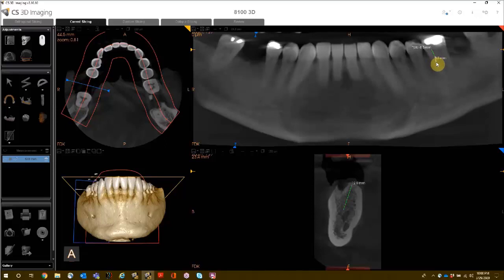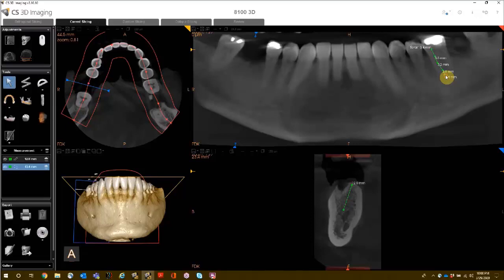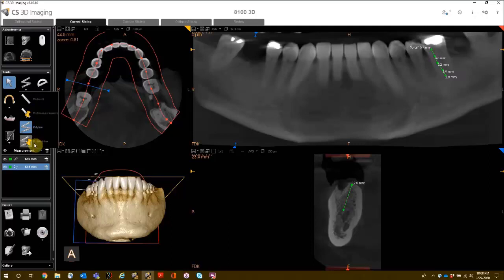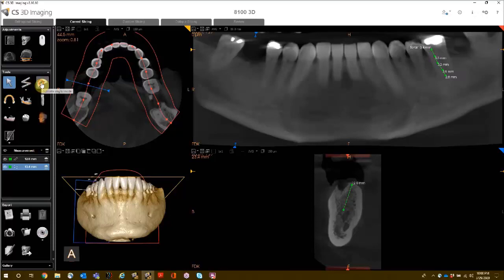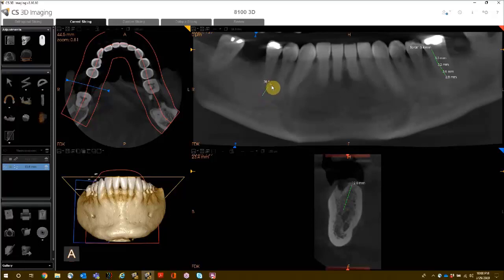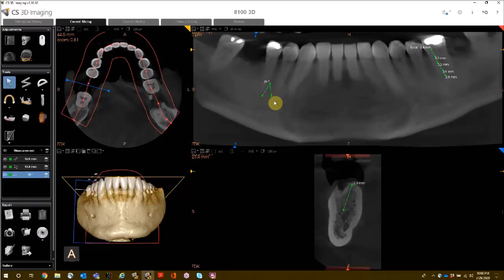When measuring a polyline measurement, do several single left-clicks and double left-click when you are finished. There is also an option to do multi-polylines. Activate the angle mode if you need to do an angled measurement, then single left-click where you want to start and single left-click when you are done.